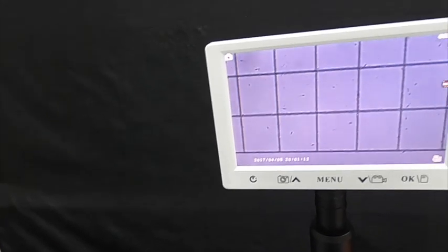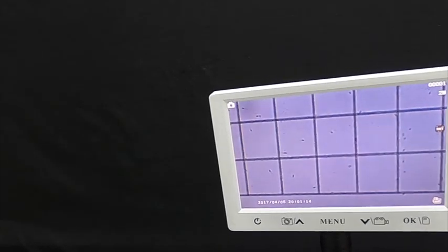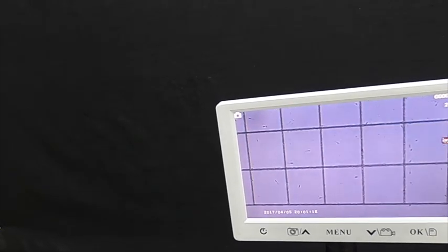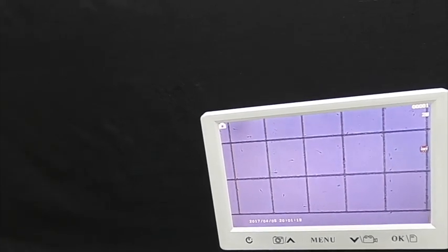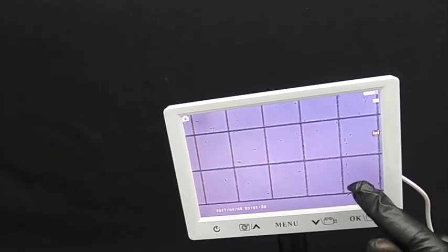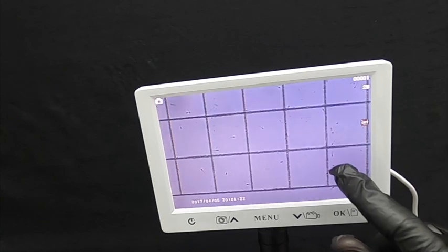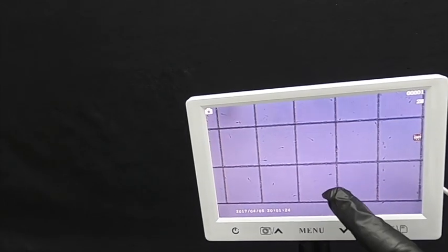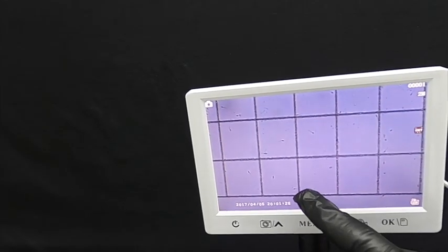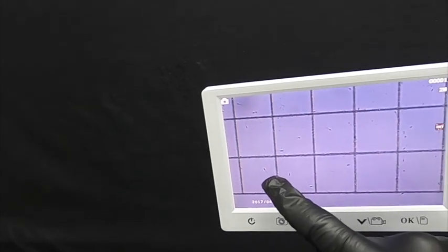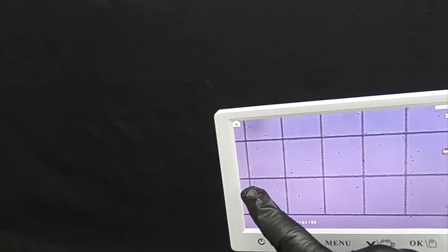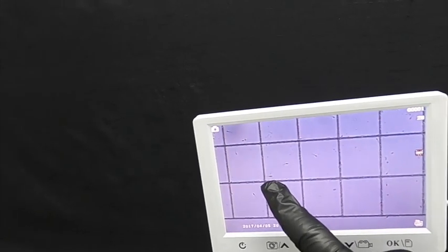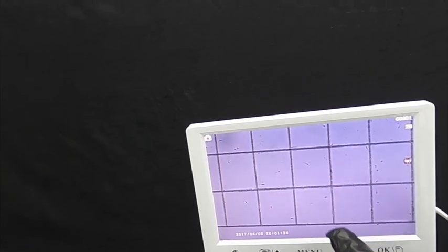Adjusting the brightness a little bit. Now we're going to count all the ones we can see within the grids. Starting from right to left: 1, 2, 3, 4, 5, 6, 7, 8, 9, 10, 11, 12, 13, 14, 15.